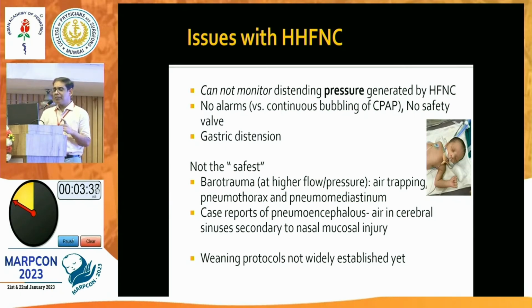And there is no safety valve, like CPAP has got a safety valve with a pressure manifold. And there are no alarms. With the bubbling, we know that the CPAP is working. With high flow, it's a very silent thing. So we don't know whether it is getting delivered, or when the prong is out, we don't know how much pressure, how much flow is going.